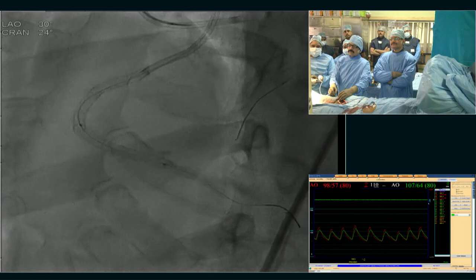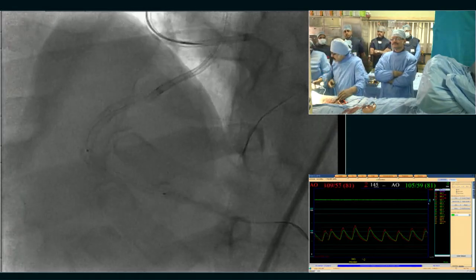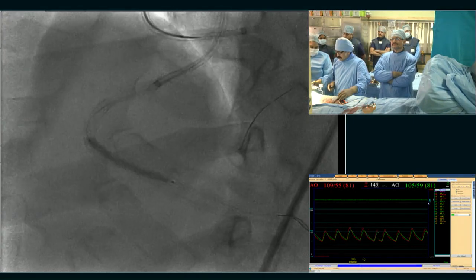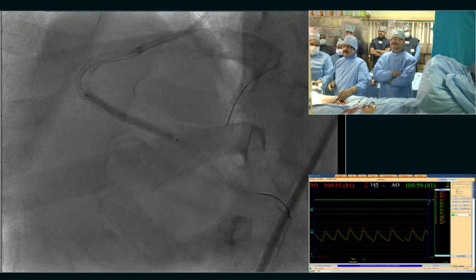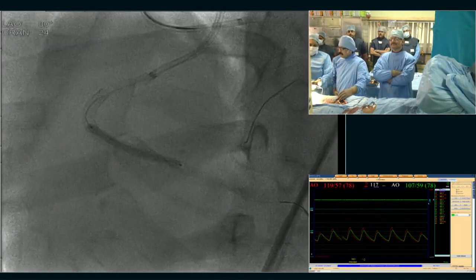This one you can do. This is a 3 into 40 DEB. The nominal pressure of this is around 6, 8. You can go. 30 seconds. So there finally, this guy.